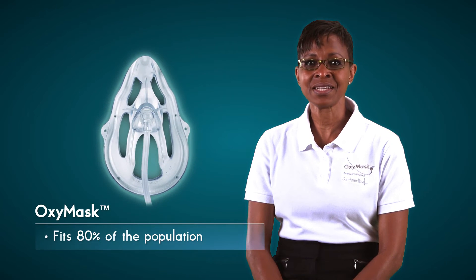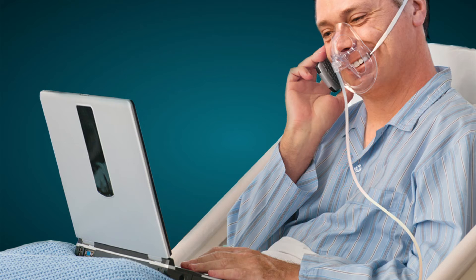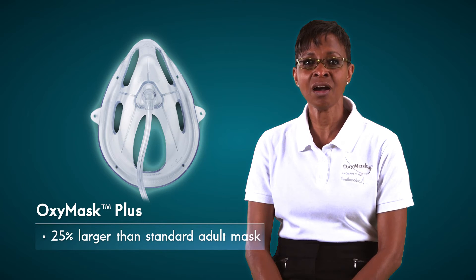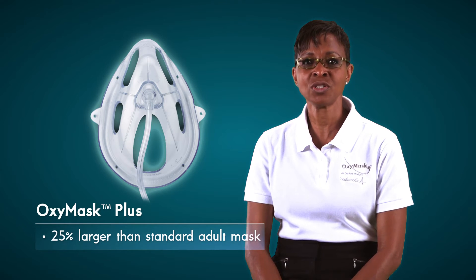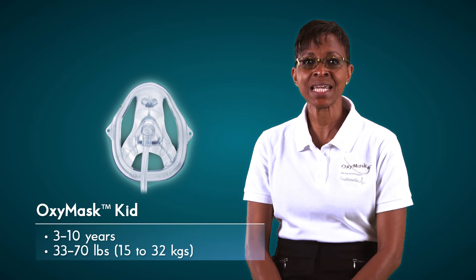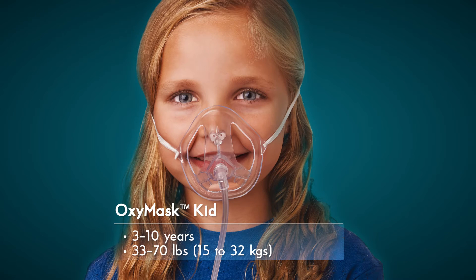Now let's look at the OxyMask family of products. This is a standard OxyMask. This mask fits the average size face, approximately 80% of the patient population. Here we have the OxyMask Plus. These masks are 25% larger than the standard mask and are used for patients with a larger face and/or a beard. The OxyMask Plus may also be used on the patient whose mouth remains wide open while breathing. For pediatric patients, this is the OxyMask Kid. These masks are for children 3 to 10 years old or within the weight range of 33 to 70 pounds, 15 to 32 kilograms. This mask may also be used for an adult patient with a smaller face.